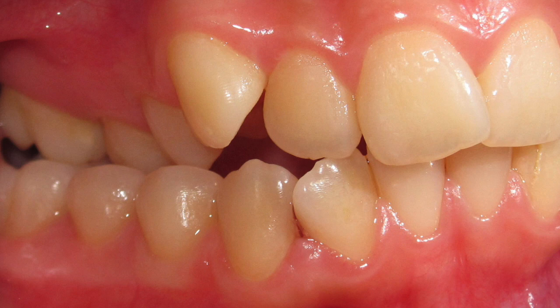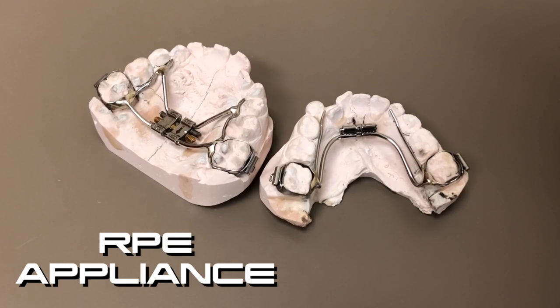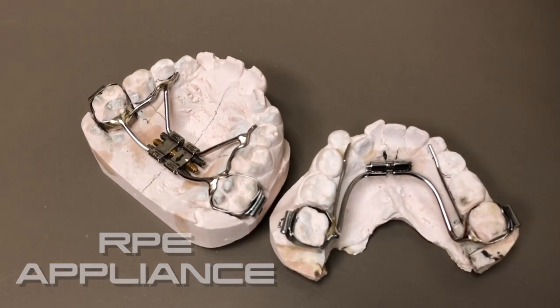It can be in the front or it can be in the back where the teeth just don't fit together the right way. There's usually a simple way that we can improve this relationship and help a young person's bite get back on track, and we call that expansion of the jaw, rapid palatal expansion, or we use an RPE.